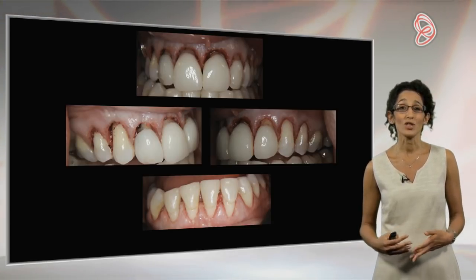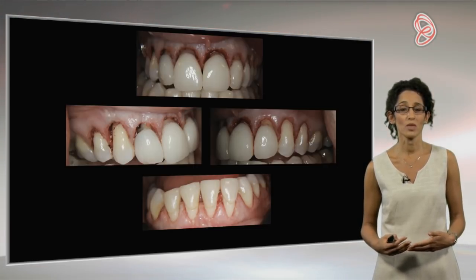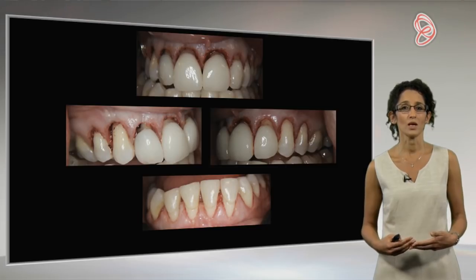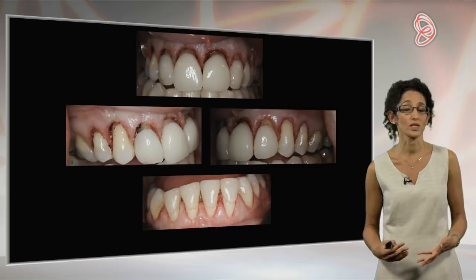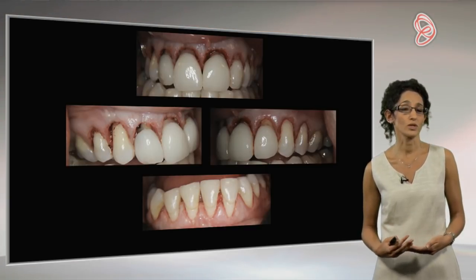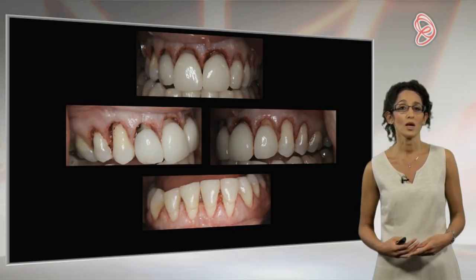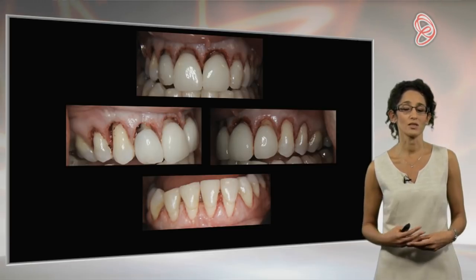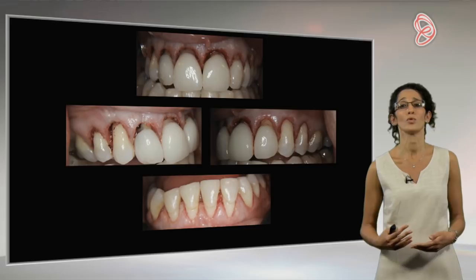So contraindications for doing something like this might be if those crowns were particularly bulky, in which case I couldn't get subgingivally without really pointing the tip in towards the bone or the root surface, and of course I don't want to do any damage. Likewise, if those tissues were really thin, I wouldn't do it flaplessly either, because I'd just end up ablating away the soft tissues. But in this case, you can see the tissues aren't particularly thin, and so we've gone in flaplessly and we've removed the bone.